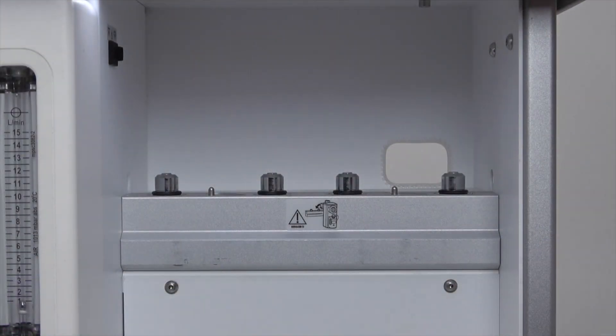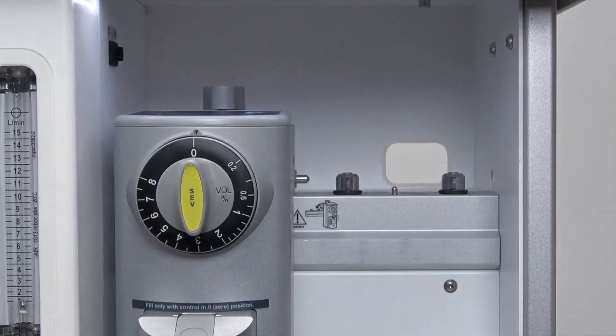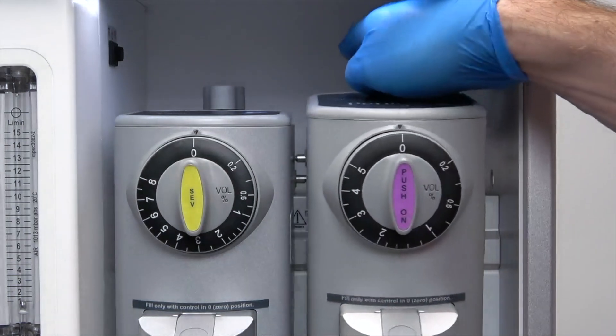Select-a-tech compatible back bar for mounting up to two anaesthesia vaporizers, including the market-leading Penlon Sigma Delta, which is available for isoflurane, sevoflurane, and halothane.